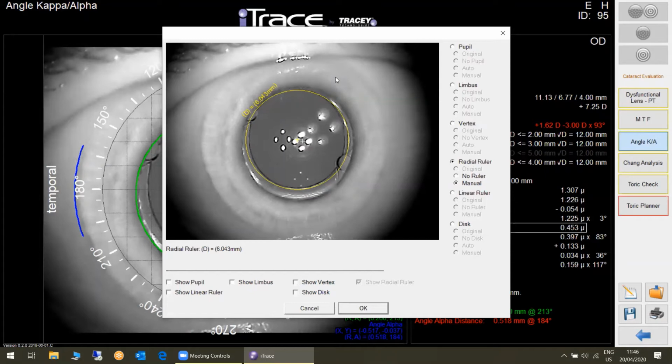Why? It could be a memory effect. It could be that they are using a different material. It could be that the lens was damaged because it went through a too small aperture, or it was preloaded too long. I don't know. But he went to the manufacturer and he said, your lens is not completely unfolded. I said, impossible. And then he showed them the images, and they looked at several ones, and they discovered it was a problem with the material, and they changed the complete production.